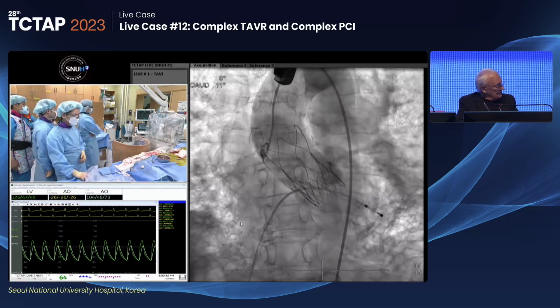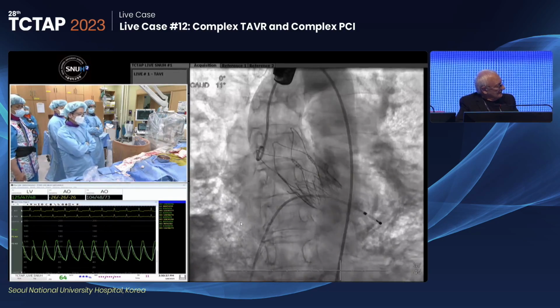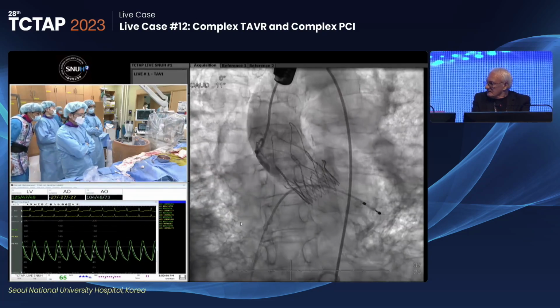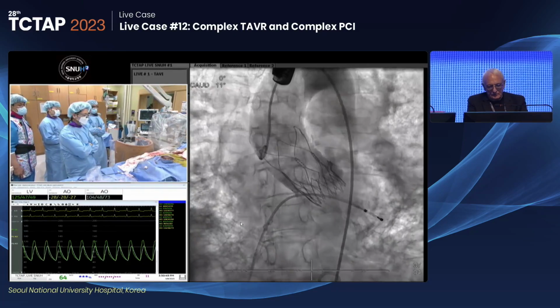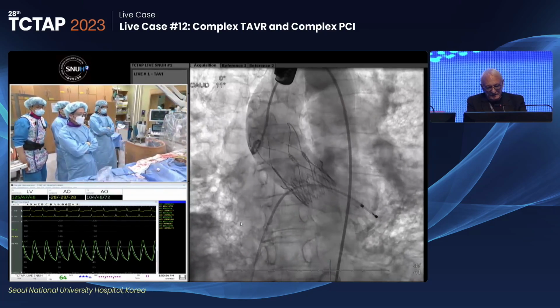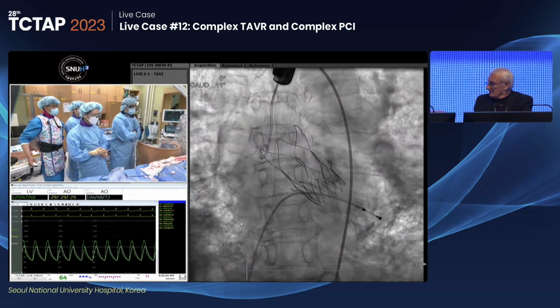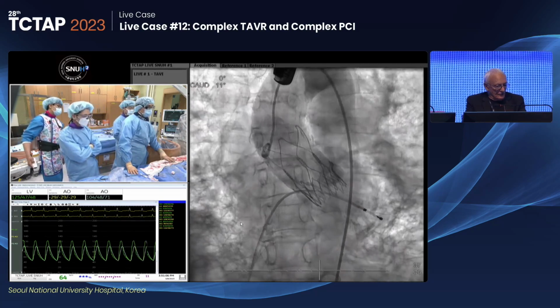I don't think it's trivial, by the way, but with AR it looks a little bit different. You can see here now, if you try to re-enter the ventricle with these large arches, it's very difficult, or tricky, to get really into the right track, not to go behind them. And I don't think that you can do more with this valve now. The question is whether you need it or not. I think you can leave it.